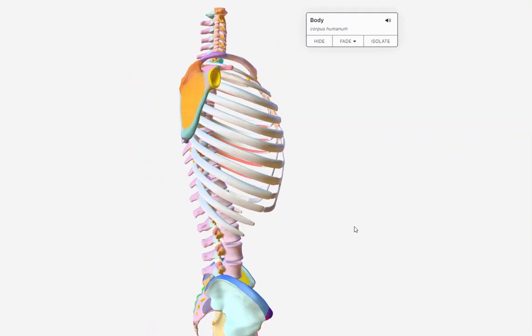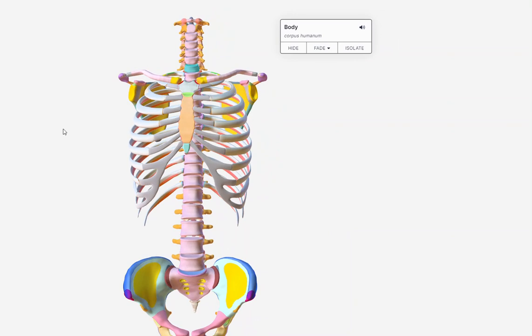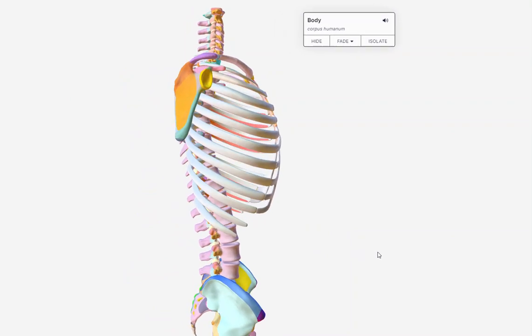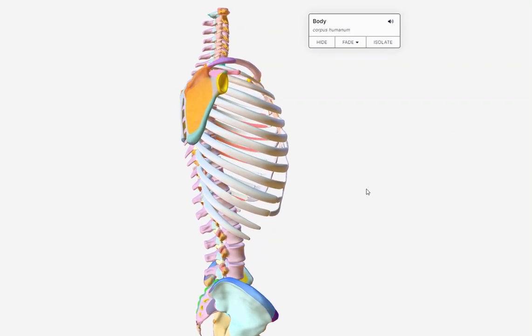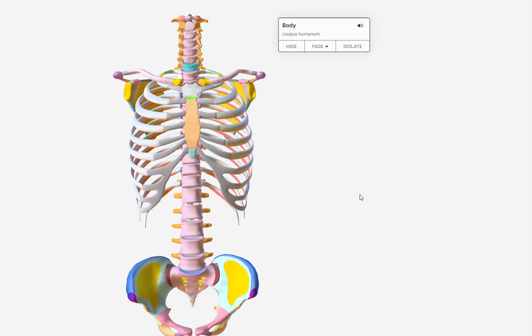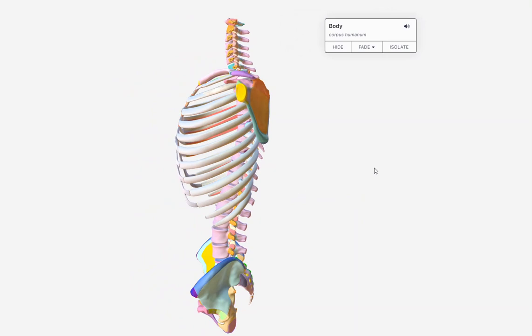Now, the way that we name our laterals is, in this case, I have my patient, remember, this is their left side, this is their right side. So if I turn my patient like this and I put their left side against the Bucky, that would be a left lateral position, a true lateral. The patient's mid-sagittal plane would be parallel to the IR, left lateral. Put them back. AP projection, turn them so their right side is touching the Bucky. Now we call that a right lateral position.